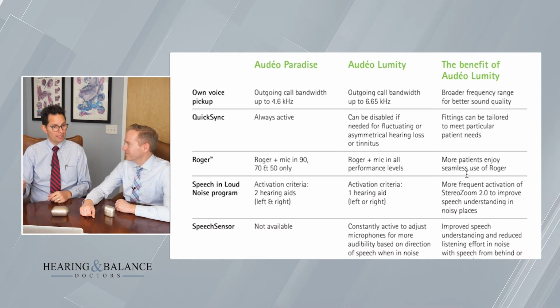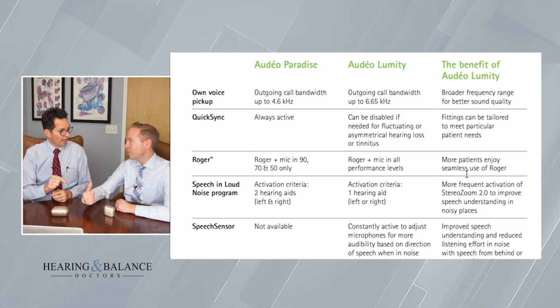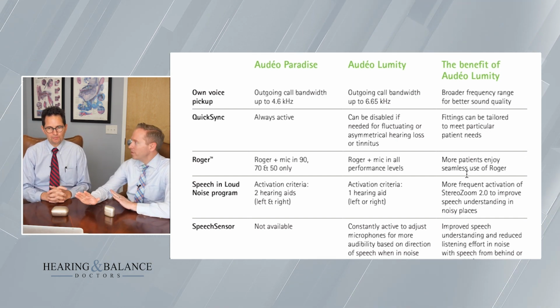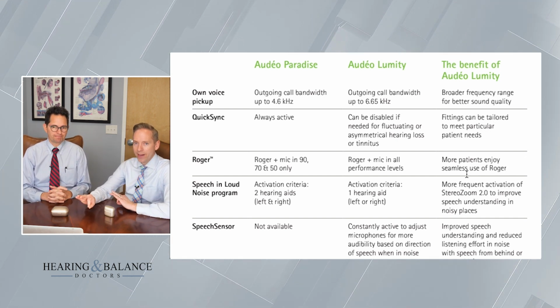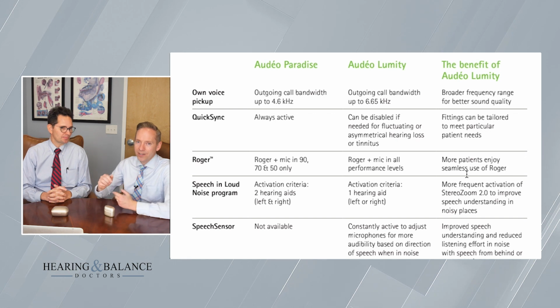So you do have to play with that to be comfortable, but how cool that the patients have that ability to choose. That's what I was going to say. It's nice to have more options. Flexibility is good. Some people don't want to play with it much, and the AutoSense is very automatic. But if you like to play with it a little bit, the slider on the app gives you a little more flexibility and a little more chance to play with it.